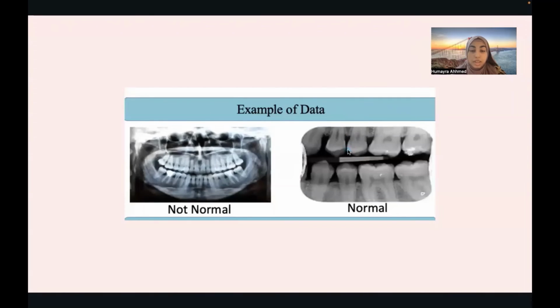These are some images and examples of cone cut errors. As we can see, this is a normal radiography X-ray, and this is not normal. Square cone cut errors occur when using a rectangular collimator. To correct a cone cut error, the beam should be recentered towards the area of non-exposure, and improper assembly of receptor holding devices can also cause this kind of cone cut.